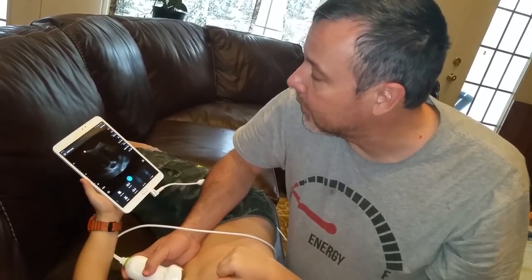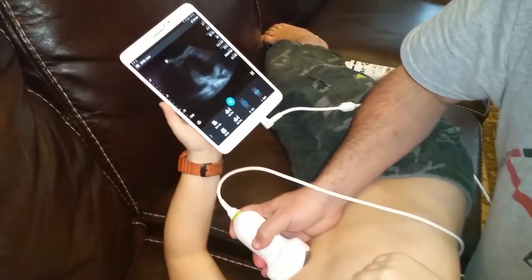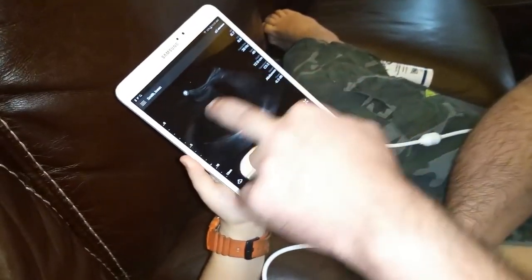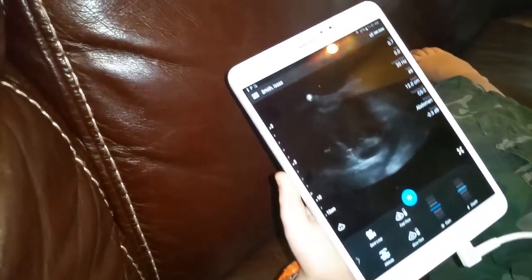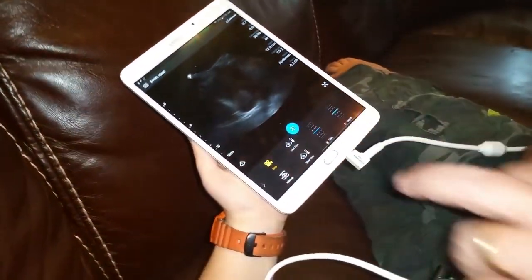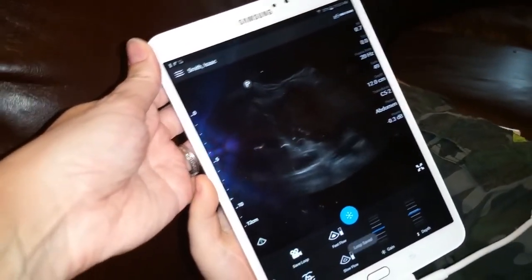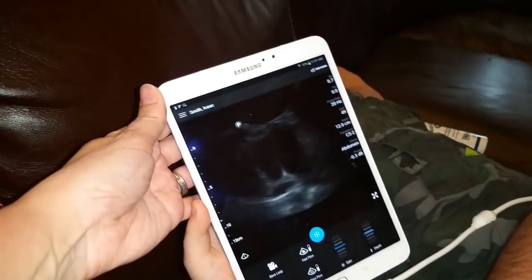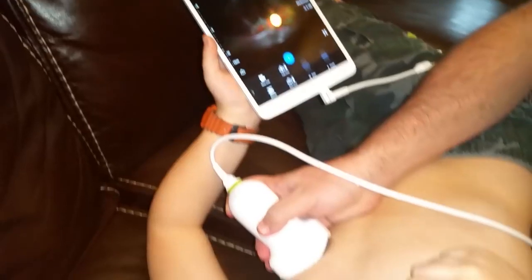So again, this curvilinear probe — not really a cardiac probe, but it's pretty versatile. Here I've got an apical four-chamber view. You can see the left ventricle and right ventricle, and you can get a hint as to what's going on with the valvular aspect of things. You can click save. It's enough for a quick gross assessment of function — this is a pretty adequate view.